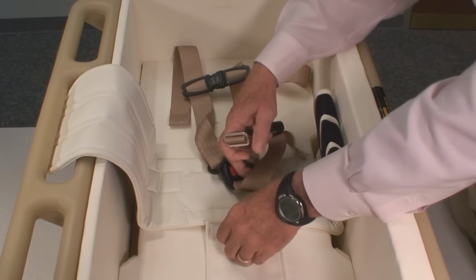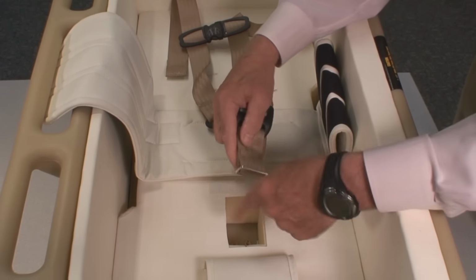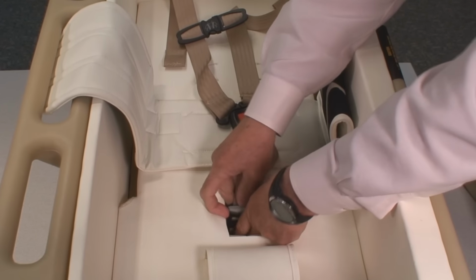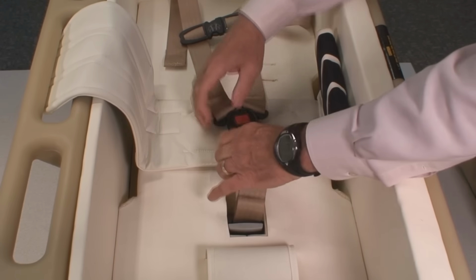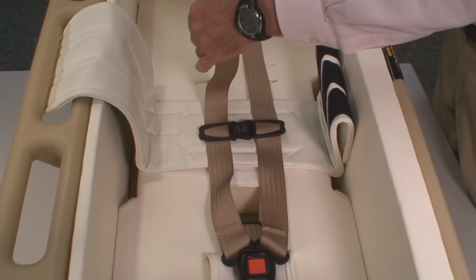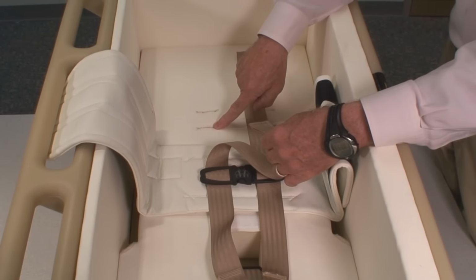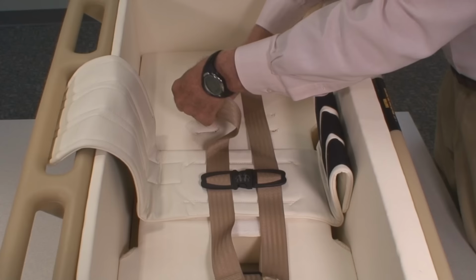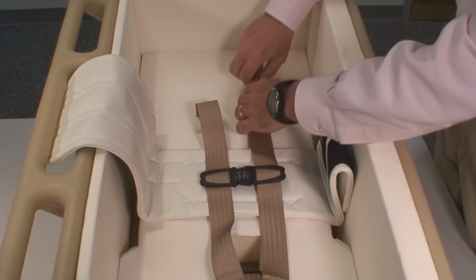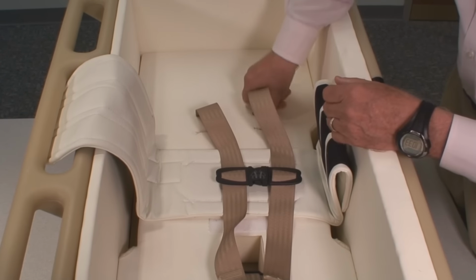Lay the harness in the bed, lift up the top flap, insert the metal anchor into the slot in the bottom of the car bed, push it all the way through, lock it in place. Now you're ready to install the harness straps. Again, the top slot is for the 3-point harness, the bottom slot is for the restraint bag. So you insert it in the top slot and push it all the way through.